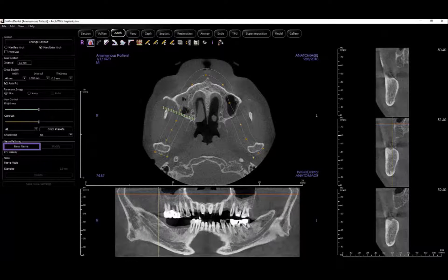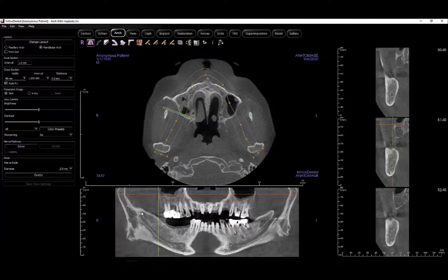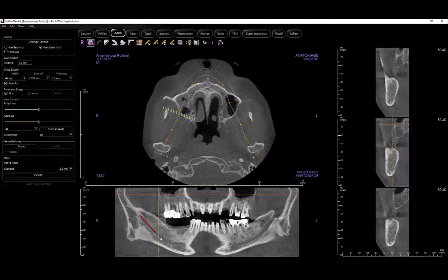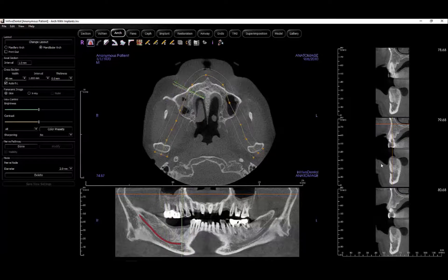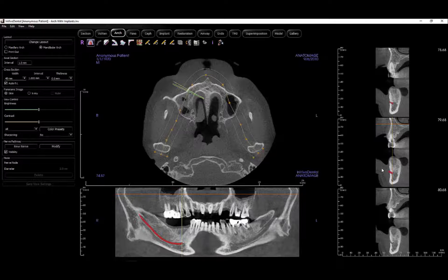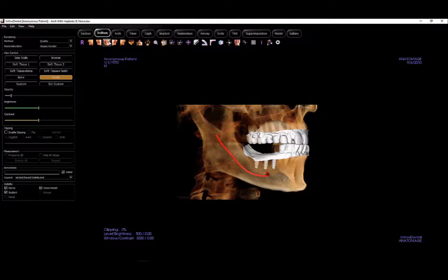Next, to trace the nerve, click the new nerve button in your control panel. Use the pano slice view to place points along the nerve canal. At the end of the canal, use the cross section windows to trace the movement through the mental foramen. Place one point inside and the last point outside for the nerve to exit, then right-click to finish. The nerve can now be viewed in 3D in the other tabs as well.